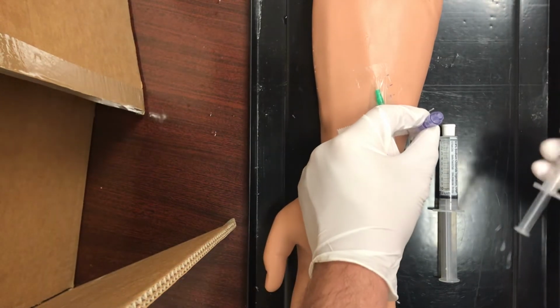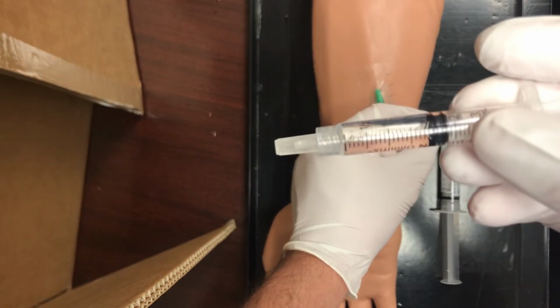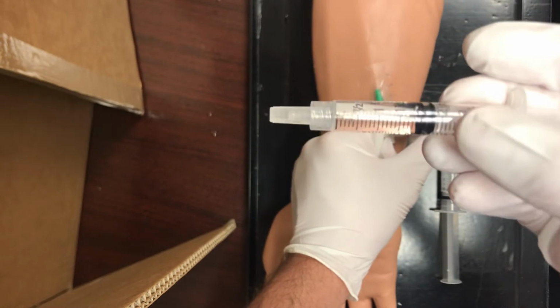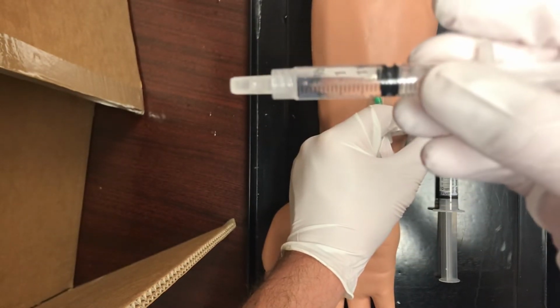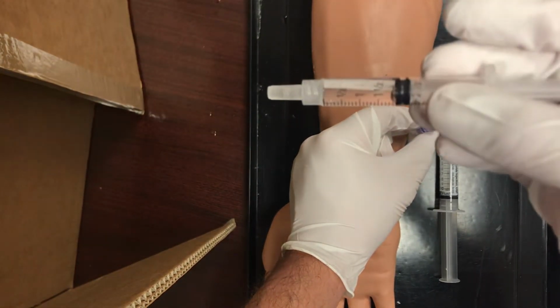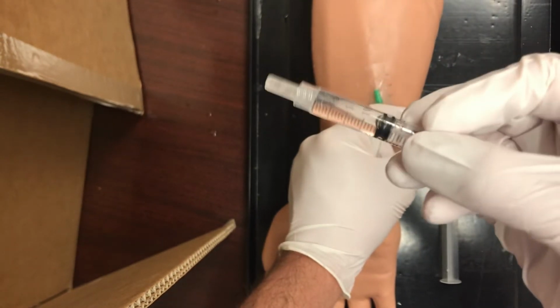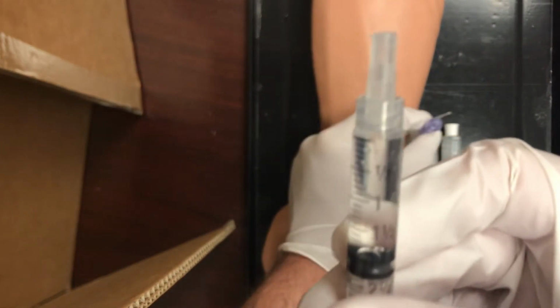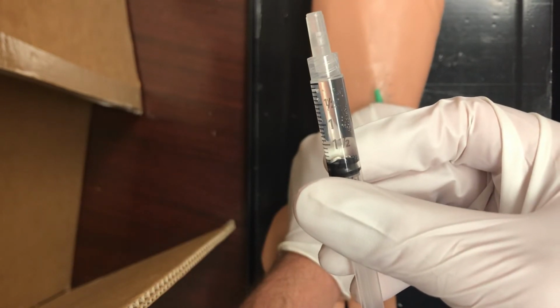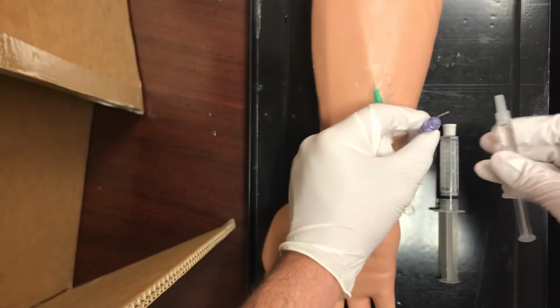So, for example, a typical medication with 2 mLs could be ondansetron or Zofran. Zofran comes in 2 mLs, which would be 4 milligrams, and the order would be for 4 milligrams, and we want to give the 2 mLs over 1 minute. So in order to do that, we're going to push 0.5 mLs, or a half, every 15 seconds. We're going to do that over 15 seconds. And I will demonstrate that.